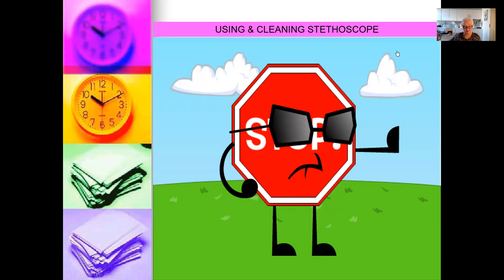Ear tips can get dirty quickly. Sometimes it's hard to tell when your tips need a quick cleaning. Getting clear ear tips can help with that. An easy way to clean inside the crevices of your ear tip is to use a cotton swab soaked in rubbing alcohol. To clean underneath the ear tips, the ear tips are removable and can be popped off.